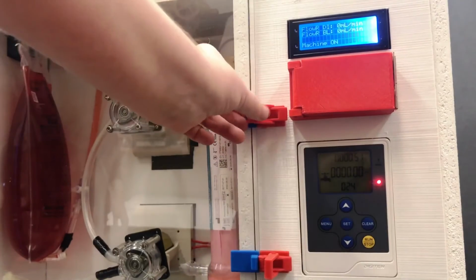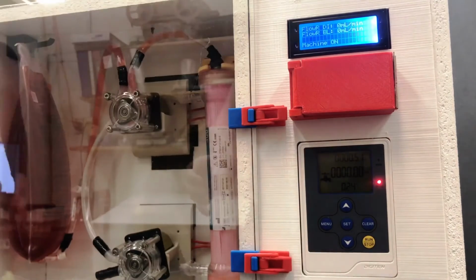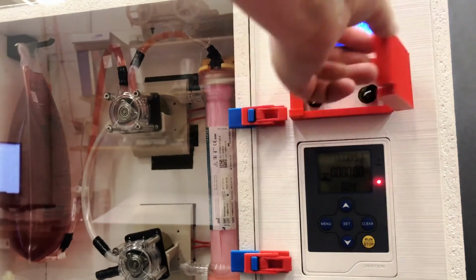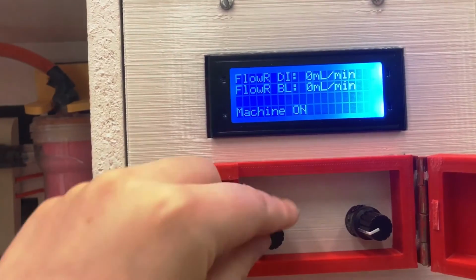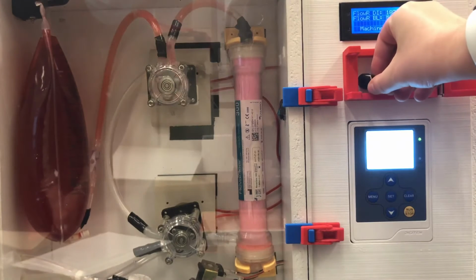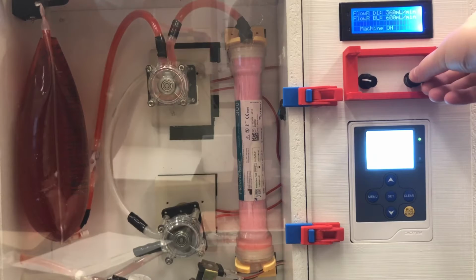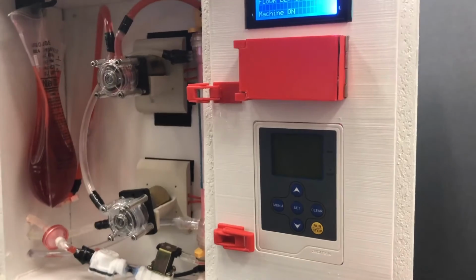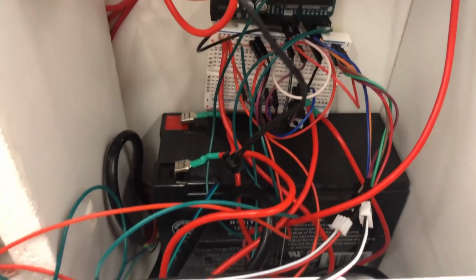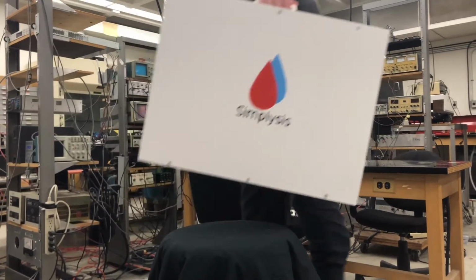This project aims to design an innovative, adaptable, user-friendly, and cost-effective hemodialysis machine for use in developing countries based on sustainable design principles. While typical commercially available hemodialysis machines cost upward of $5,000, the presented prototype costs under $500 to manufacture. The design incorporates a modular setup to ensure that individual subcomponents can be fixed or replaced as needed. Now, while this project focuses on sub-Saharan Africa, aspects of the final design should work to reduce healthcare inequalities around the world, while focusing on patient safety.